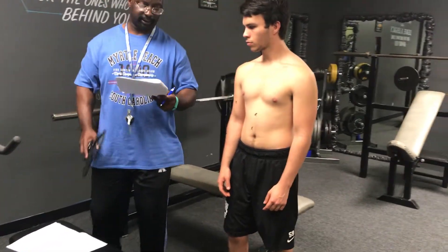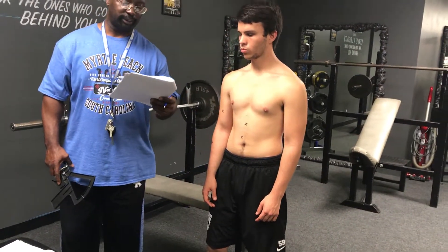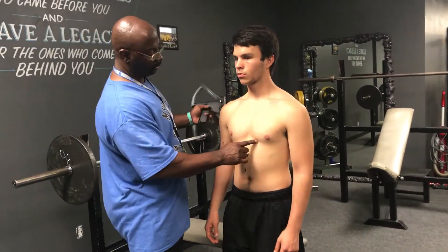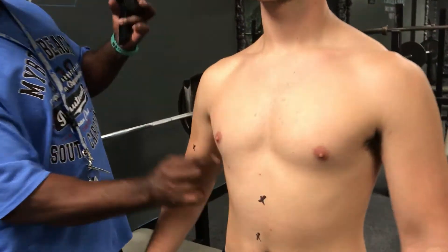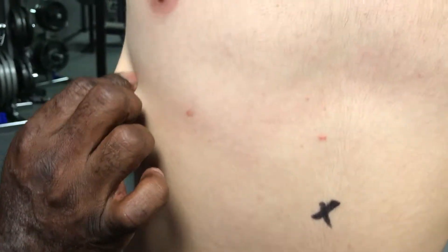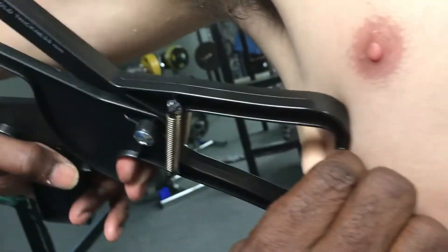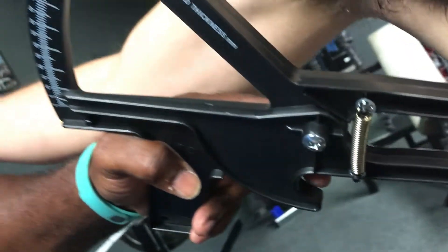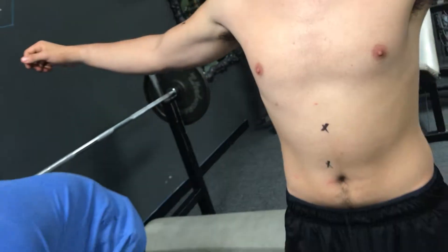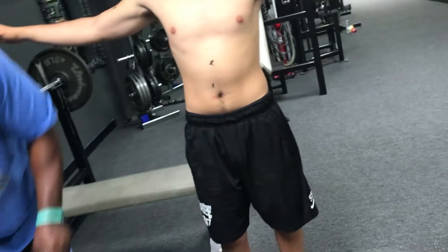Next is the mid-axillary. It's right across the xiphoid sternal body and the mid-axillary line, going right across the xiphoid process. Hold your arm up just a little and come in right here. Looks like 5. Let's do it again.